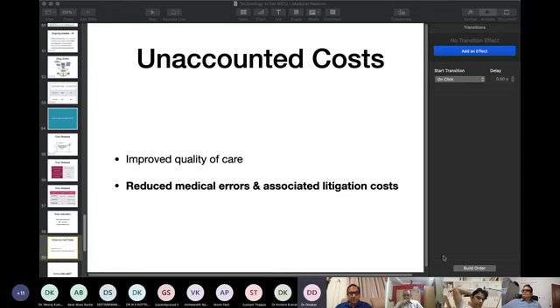Suppose anybody wants to go for a neonatal one. Touchscreen monitors have come, and almost all monitors have a touch screen. Even with the touch screen, I think Masimo takes 7 seconds, and there are many other machines showing in 4 seconds. And accuracy matters. Many monitors also have calculations, where you just enter the weight.